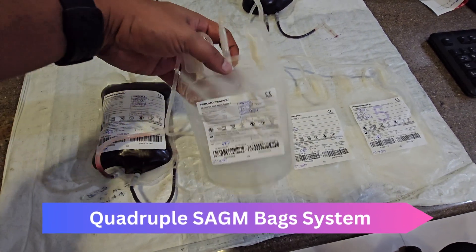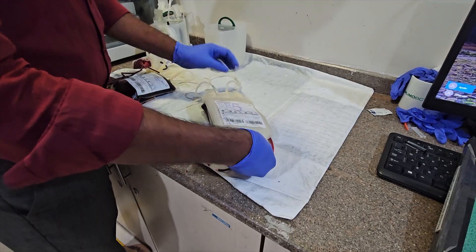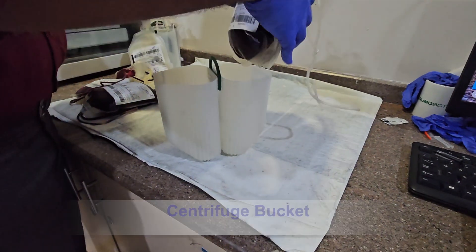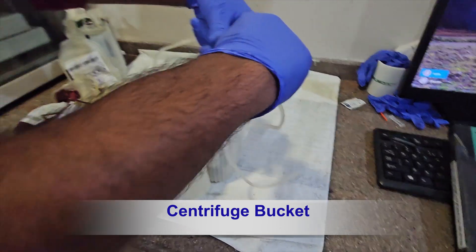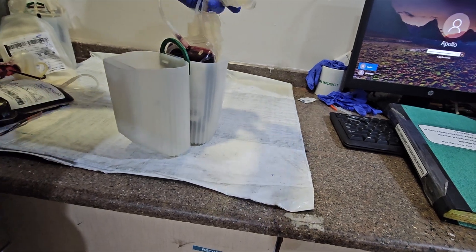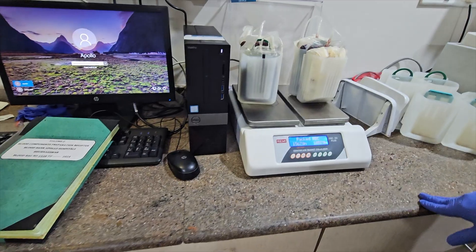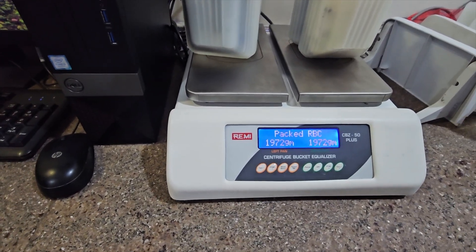This is the quadruple bag. The bags are tied and put inside the centrifuge bucket. Equal weight of the buckets is checked in the balancing machine.